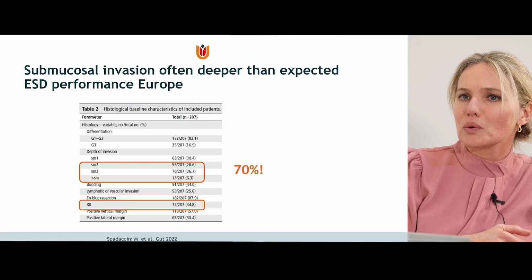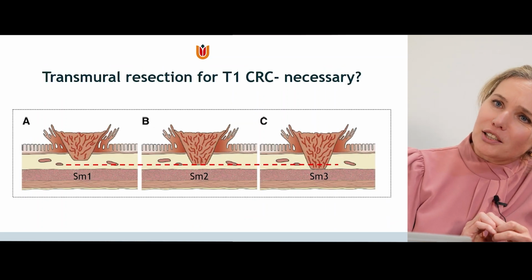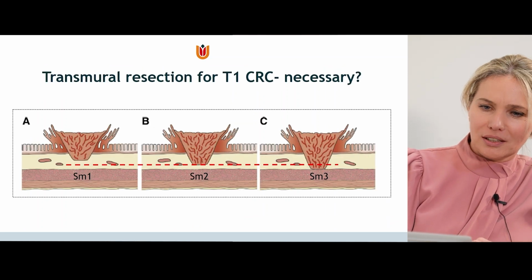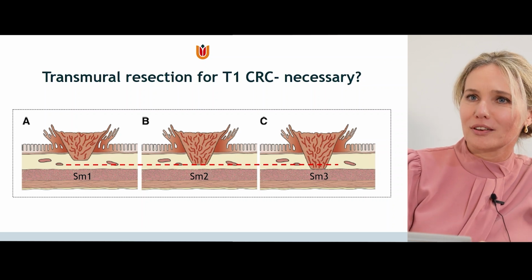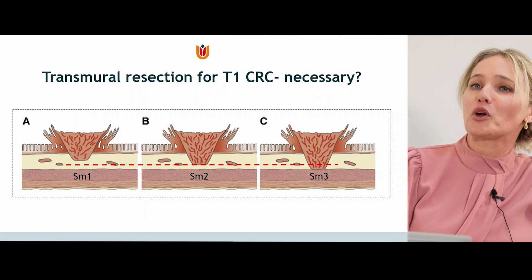So the question is, is the submucosal plane really good enough for cancer, or do we need at least a part of the muscle to have better quality histology and a better chance for a complete excision? Well, I couldn't agree more, to be honest. But if we are a little bit mean to our ESD colleagues, we would say that in known cancer, ESD is a systematic undertreatment. I'm afraid it is in many of the cases, yes.